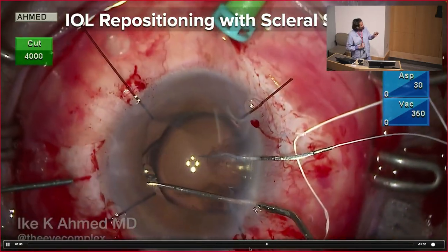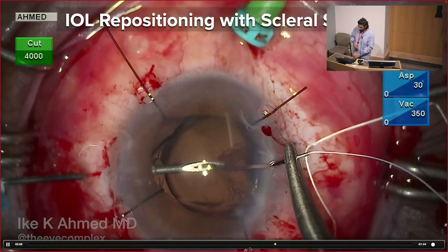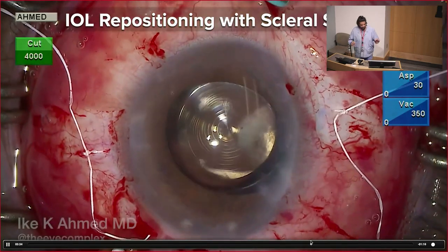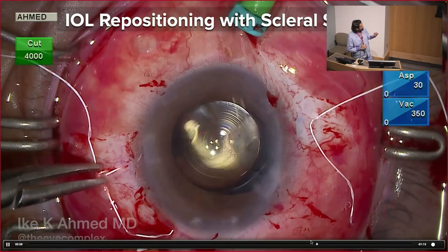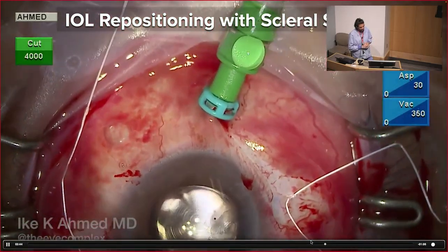And obviously you can imagine for a multifocal lens, I cannot afford to have any tilt or decentration here. The other eye he was happy with, by the way, and he had a multifocal in that eye and was happy with it. And so that's exquisite. So slip knots will adjust the tension. We'll use the Purkinje image on the coaxial reflex from the microscope. The first Purkinje was on the cornea, centering that bullseye. Back and forth, until we're happy with that.